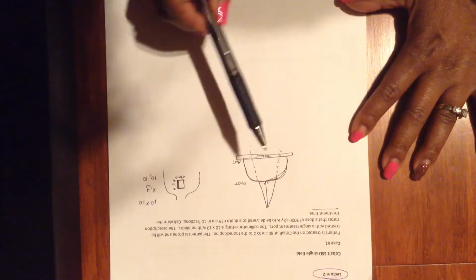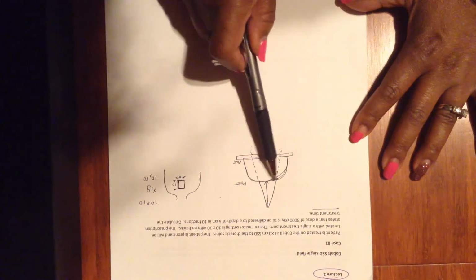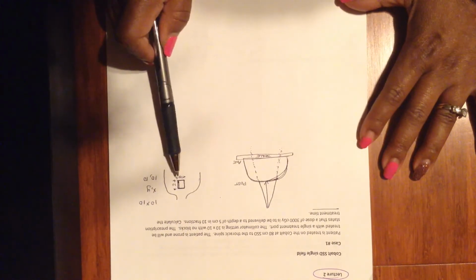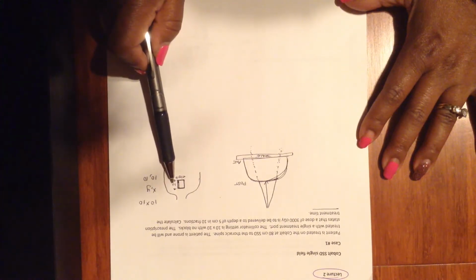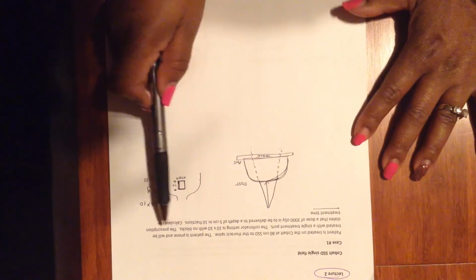I've put together a diagram here of the patient who's prone on the table. Here's the treatment port coming in on the posterior aspect of the patient. Here is a PA view, so we can see what the field would look like on the patient's back, a 10 by 10. X jaw would be 10, Y jaw would be 10. And we're going to calculate the treatment time.